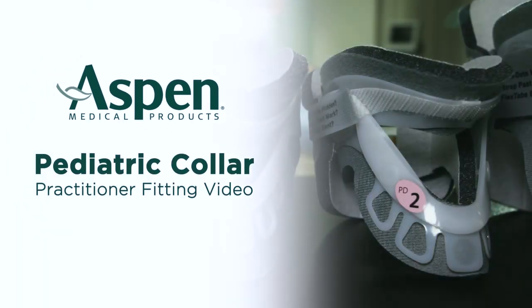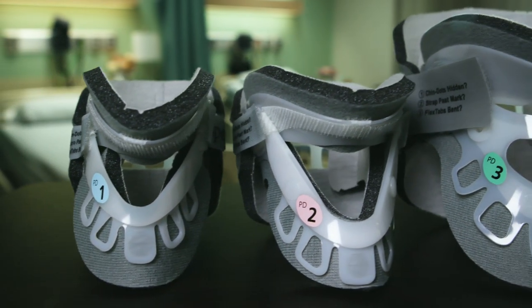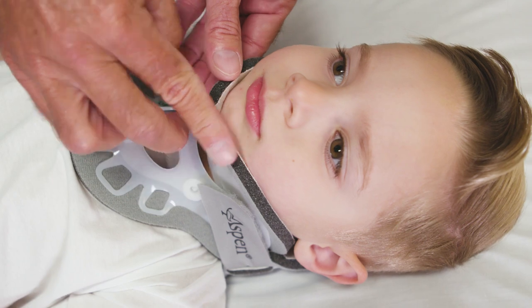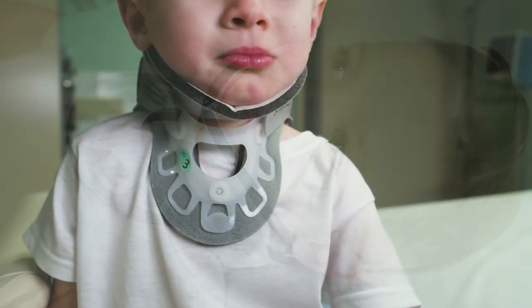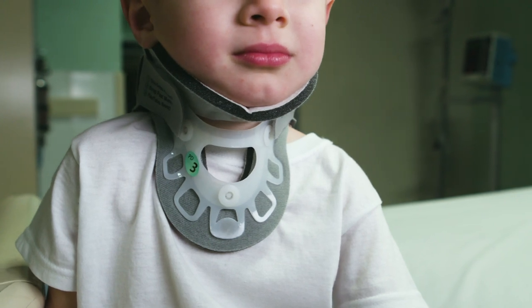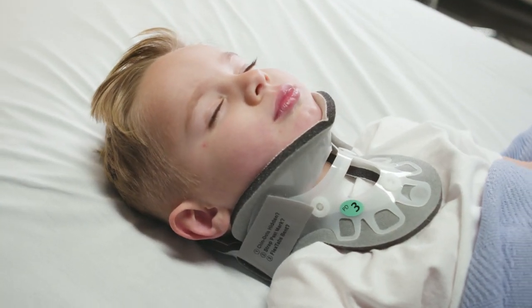The Aspen Pediatric Collars were designed with input from clinicians to meet the unique needs of children. Patented features allow these collars to conform to and cradle the unique anatomy of pediatric patients without excessive pressure on their fragile skin. Integrating innovative features of the Aspen Collar helps ensure that the balance between motion restriction and gentle care is achieved.